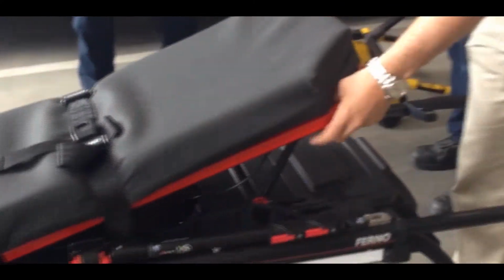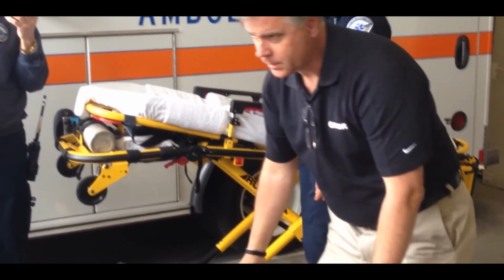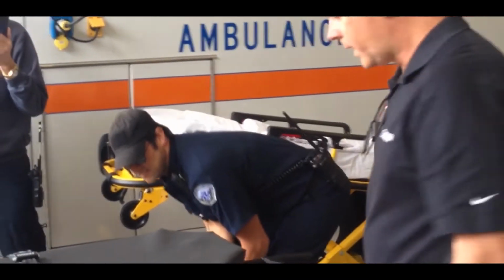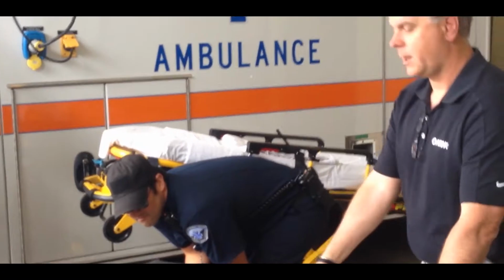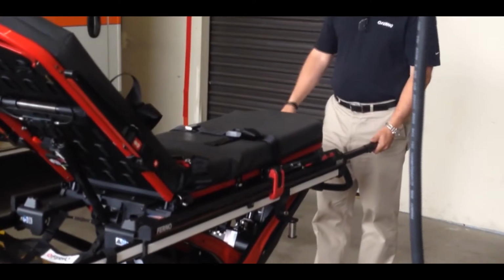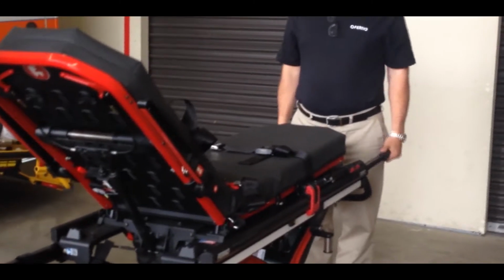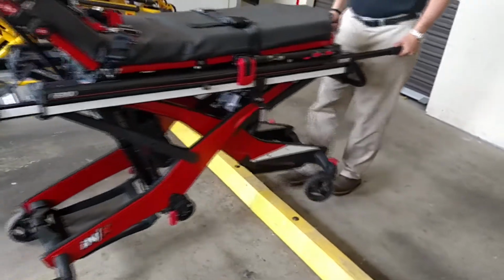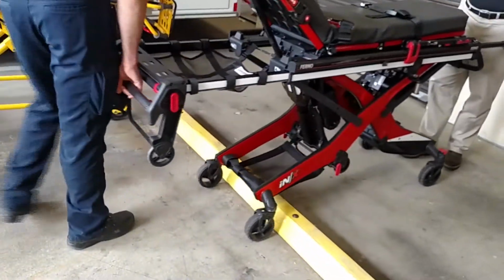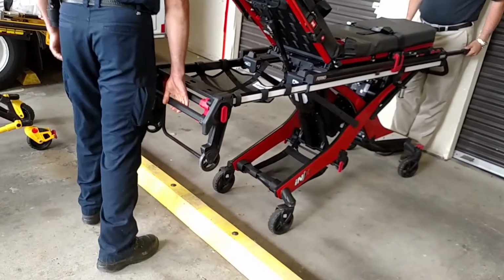One thing I wanted to hit on, and I kind of moved past it a minute ago, was the advantage an independent leg gives you. Oftentimes when we're away from a vehicle and we're rolling through somebody's yard, to negotiate an obstacle my partner and I have to pick this whole thing up. With an independent leg design, I can step right over it and just keep on rolling. Then he would take some weight off of his end, and we can continue on.